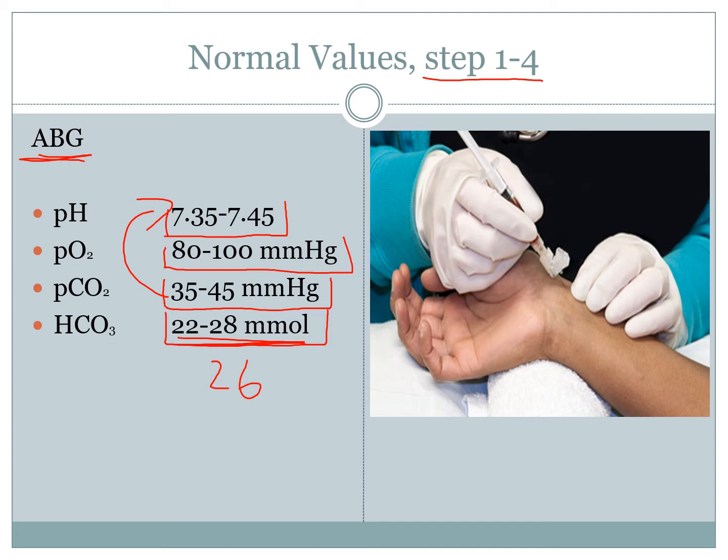Now the problem is, in practice, most of the time arterial blood gases aren't taken. Whilst in some organisations and some departments they're quite easy to take, and a lot of people are qualified in taking them, it is quite painful for the patient, and it does have higher statistics of complications as well.